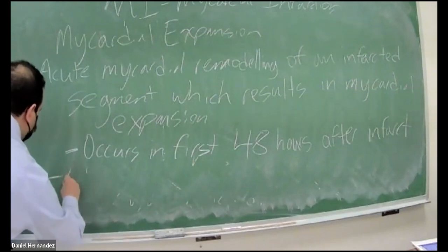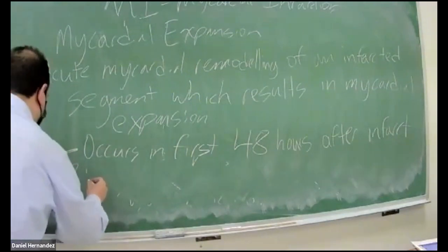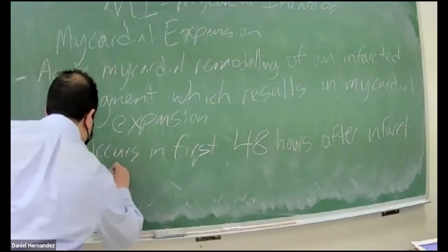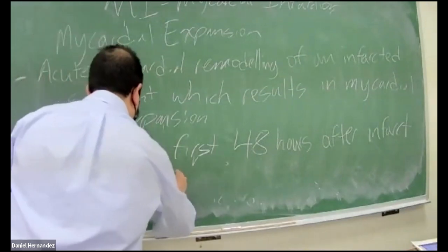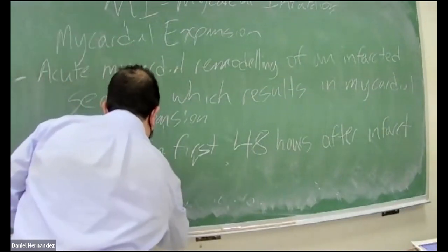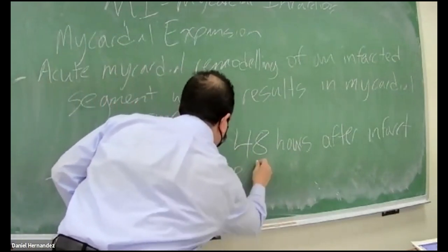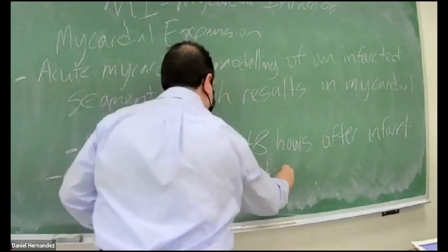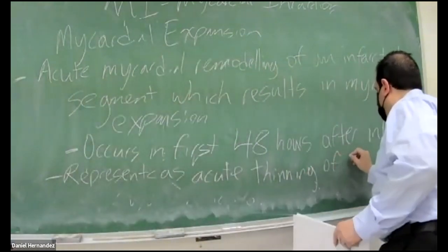And this represents an acute thinning of the myocardium.